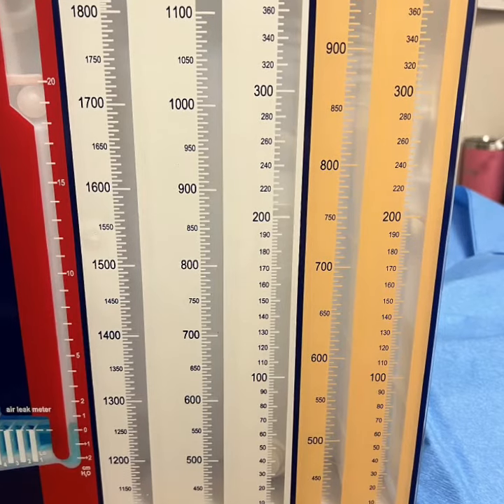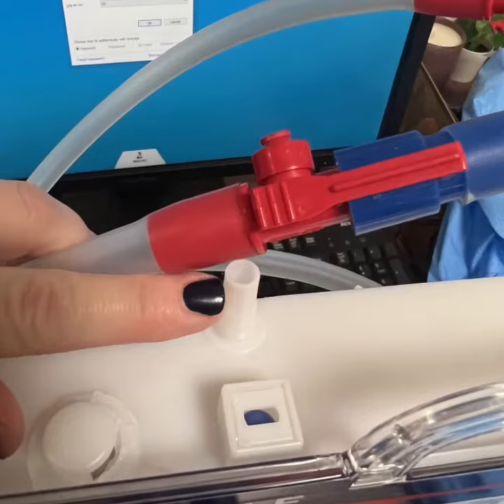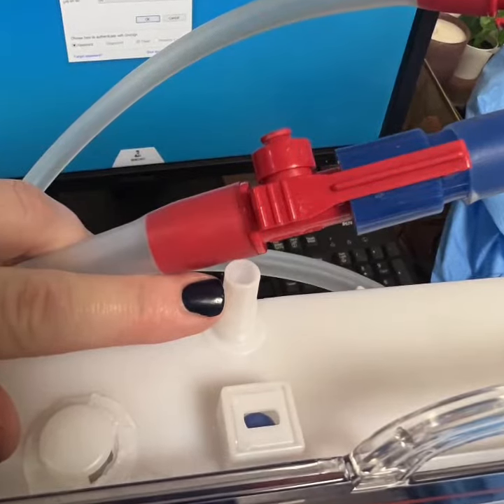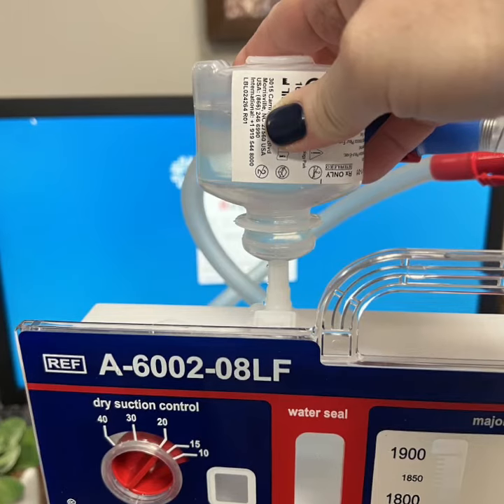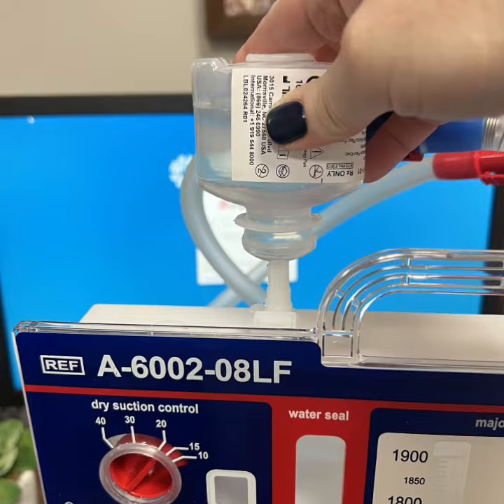The only difference is the amount of fluid that they can hold. To set up the Plurivac, remove it from all packaging. On top will be a sterile bottle of water and this suction port. Squeeze the bottle of water into this suction port. This will create the water seal.